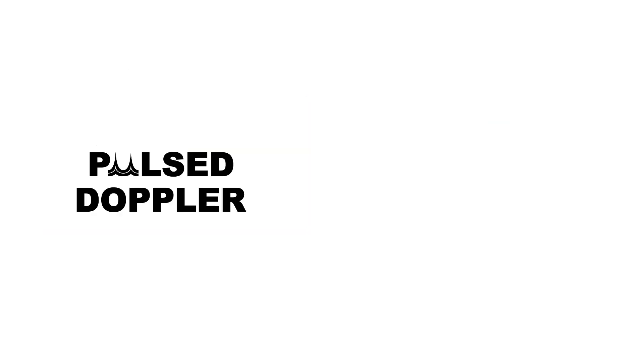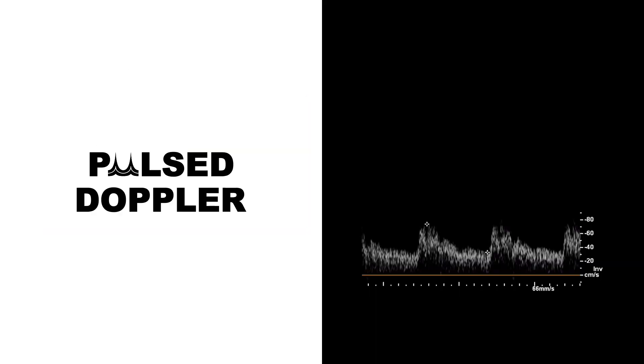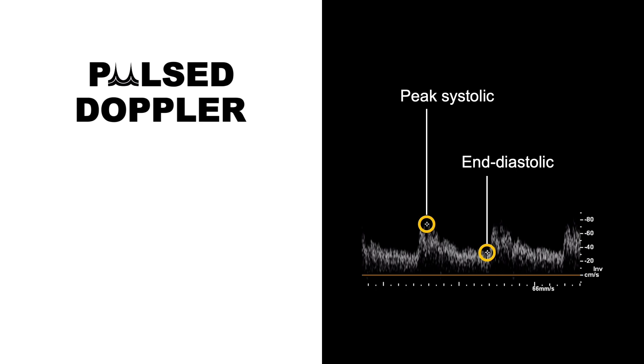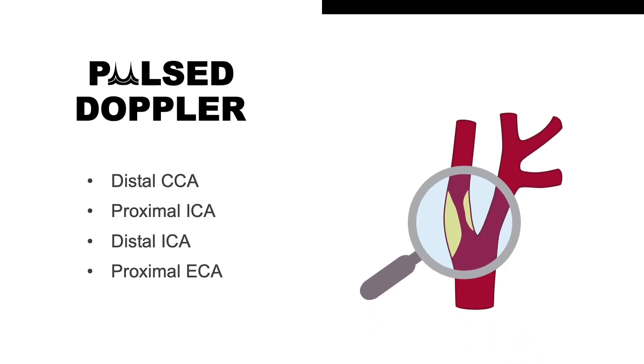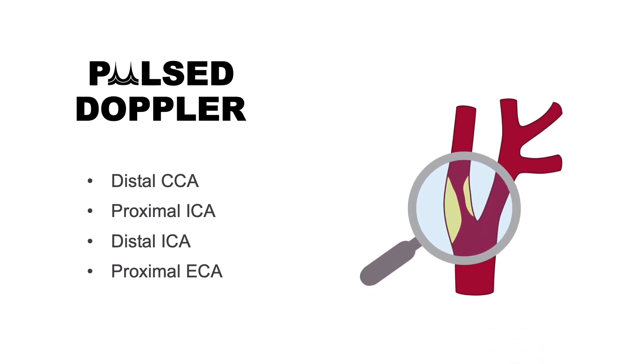Next, the pulsed Doppler should be used to obtain quantitative measurements, including the peak systolic and end diastolic velocities. These should be measured in the distal CCA, proximal ICA, distal ICA and proximal ECA. Any areas of suspected narrowing or stenosis should then be investigated.